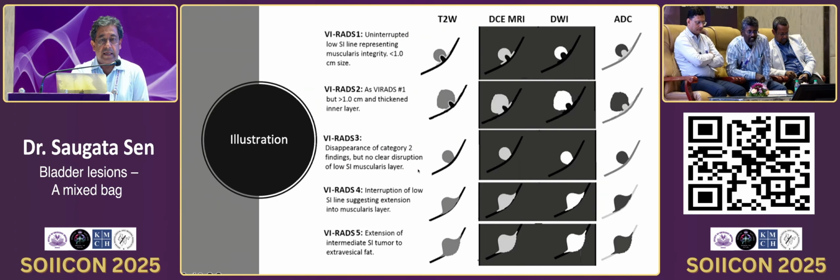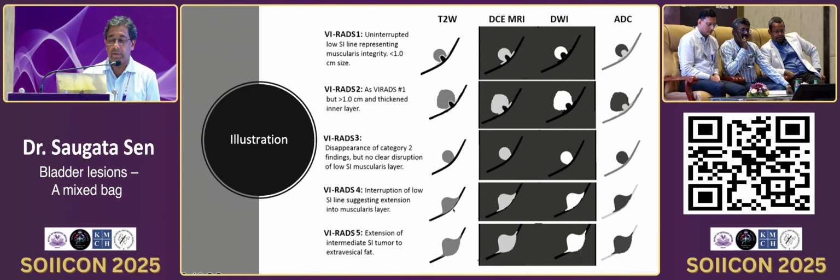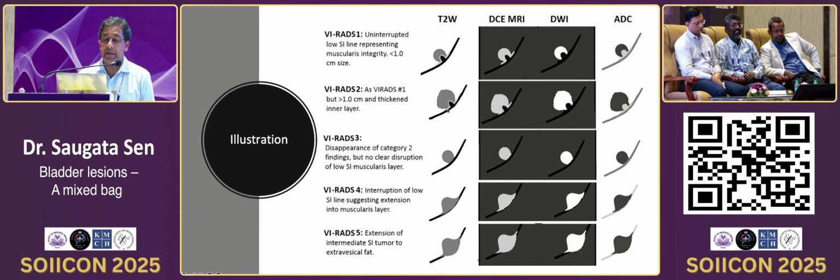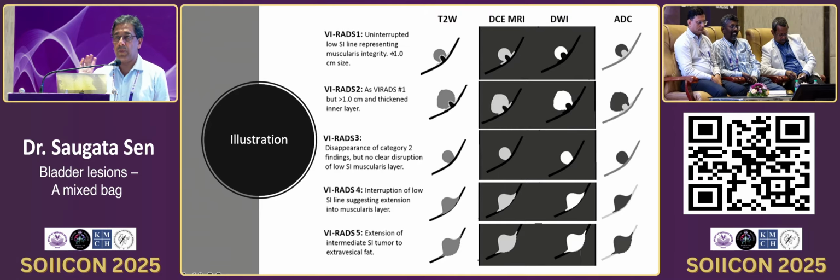Now, if you see this schematic, you will understand that V4 and V5 are very easy to diagnose. V4 and V5 is very simple, V5 has gone outside the bladder wall, and V4 is involving the bladder wall. V1 and V2 are also easy to diagnose because you can see an uninterrupted low signal intensity between the tumor and the bladder wall. Same here. V2 is also the same, that is uninterrupted low signal intensity between the tumor and the bladder wall. The difference being this is less than 1 centimeter and this is more than 1 centimeter. So these two are basically the same except for the dimensions, less and more than 1 centimeter.